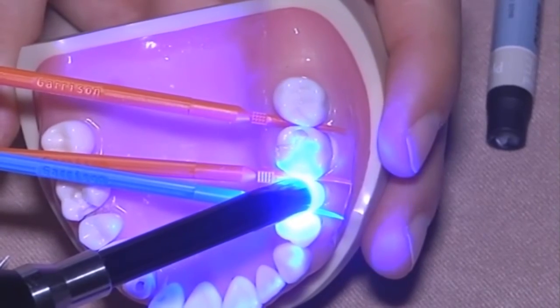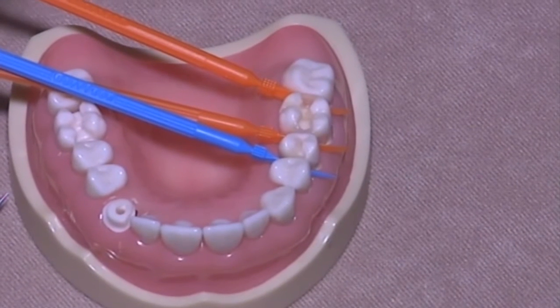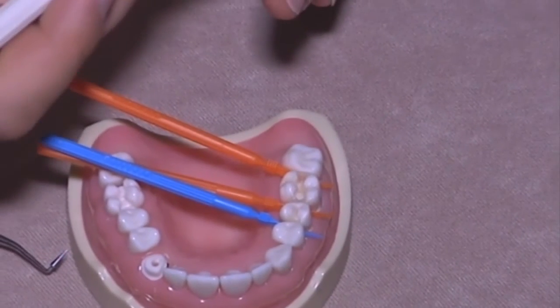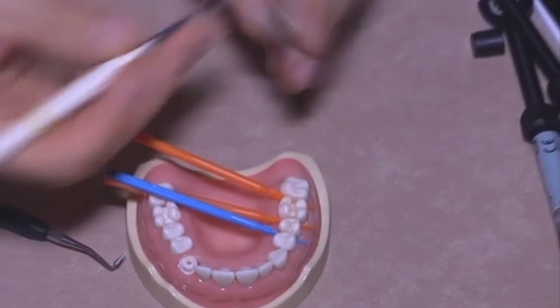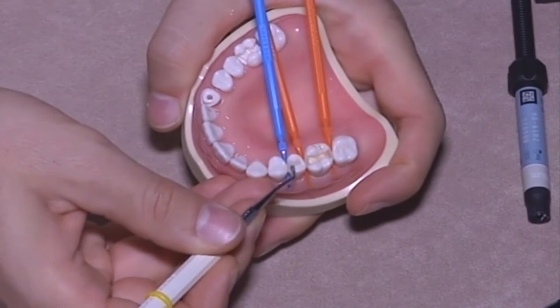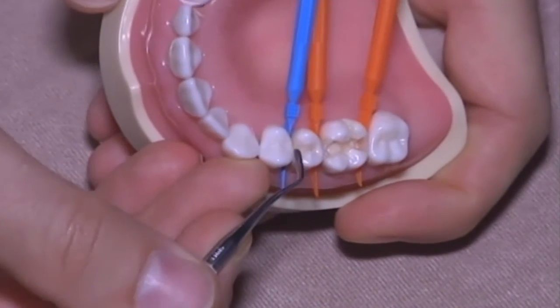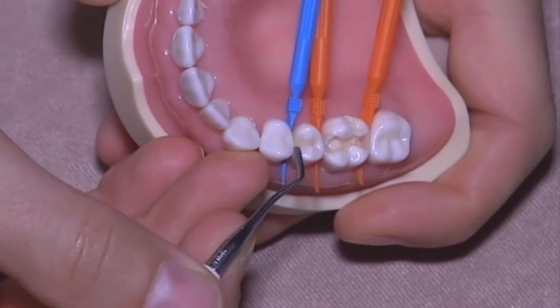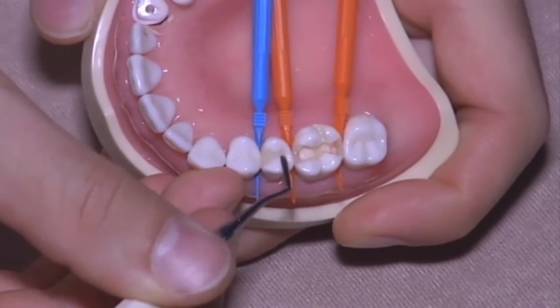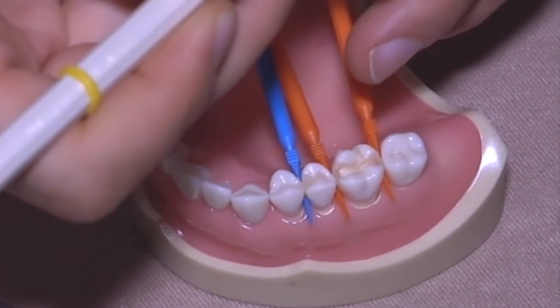This is a really small cavity with 2 layers. We will complete it. You can perform your restoration on the other side. A little bit of composite is missing.